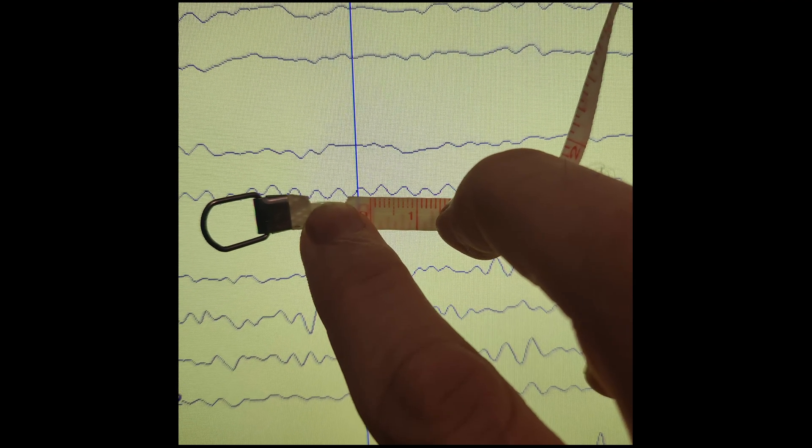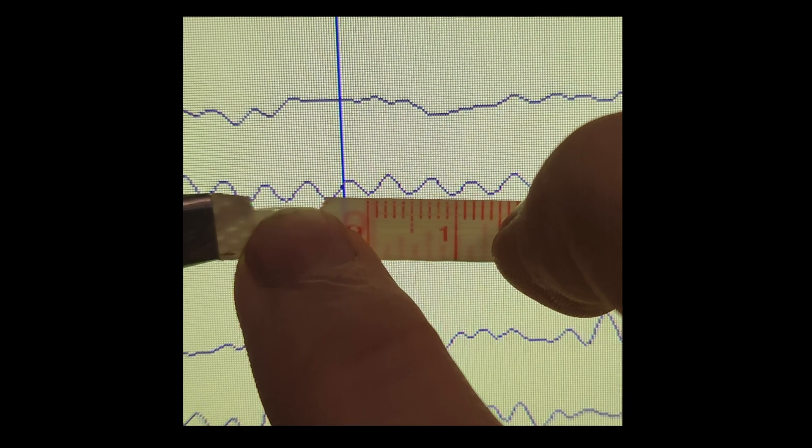We're going to zoom in just a bit more and we're going to look at that wave, the first wave after that blue vertical line. So not the one that's intersected by the blue vertical line. If we measure this wave, as I measured the wave with a ruler, we're going to measure across the baseline of the EEG channel.